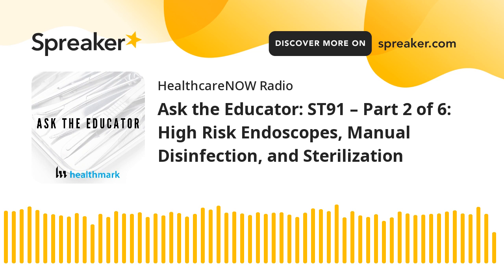The FDA recommends you do more with your duodenoscopes, like sterilize them or liquid chemically sterilize them and culture them, and transition to newer types that have either disposable parts or are designed to more efficiently reprocess. But we see a lot of facilities still using the older types of duodenoscopes, so we do need to do more with them, but really prioritize what's already sterilizable. Get that to Central Sterile to do the sterilization.